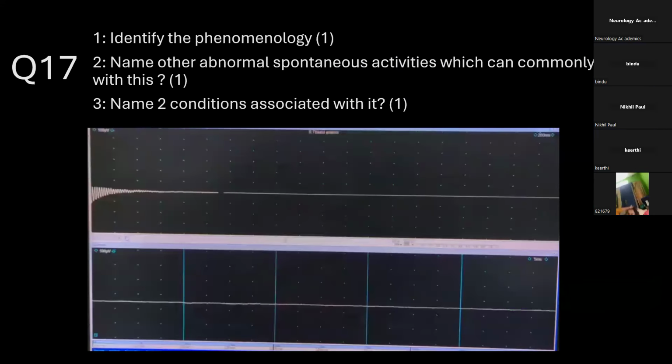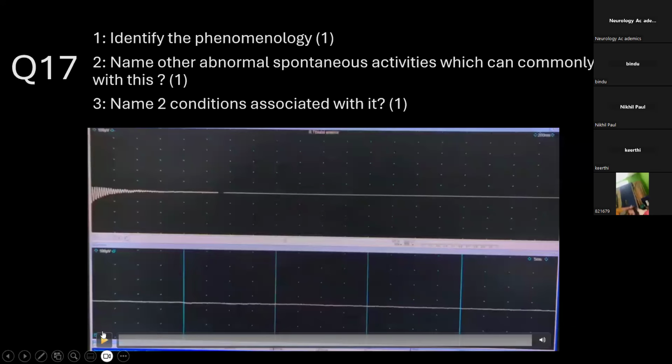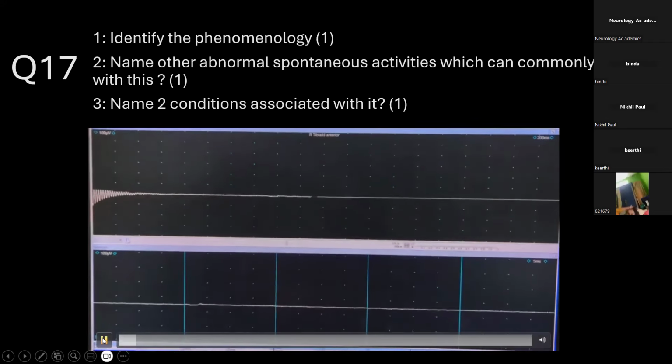Next question. Identify the phenomenology in this video. Name other abnormal spontaneous activity which can commonly co-occur with this, and name two conditions associated with it.